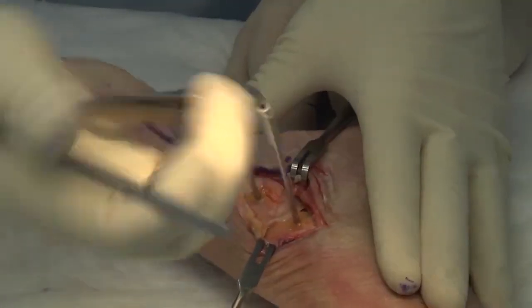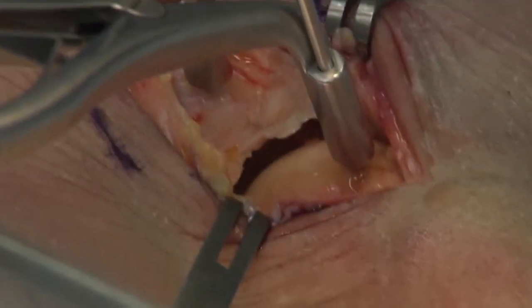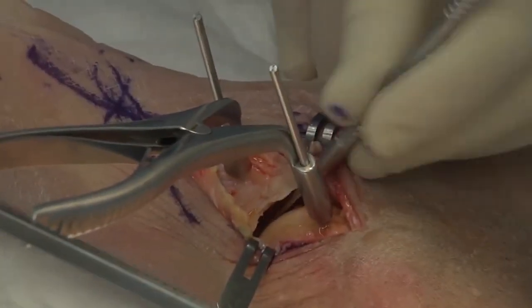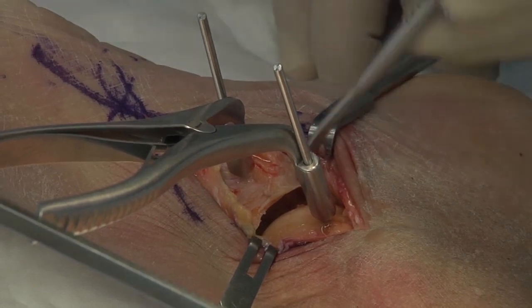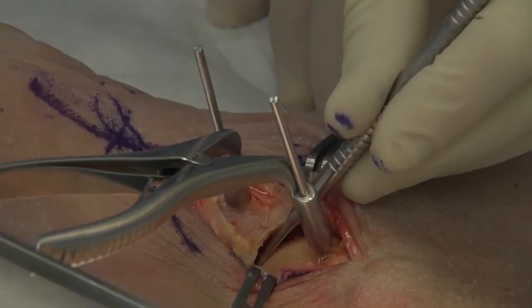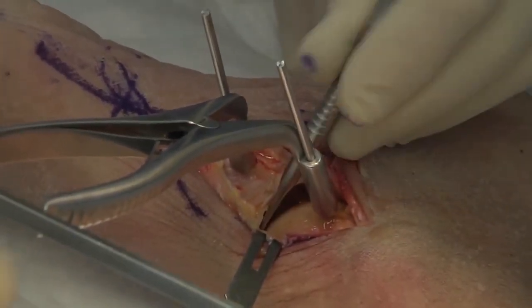With a spreader like this, slide it down — that allows you to free up your hands. Now we can get in there quite easily and work on scraping. An important side note: after the joint is prepared, the lateral side of this joint you can usually get with a curved small mini lambotte or a small curved curette.